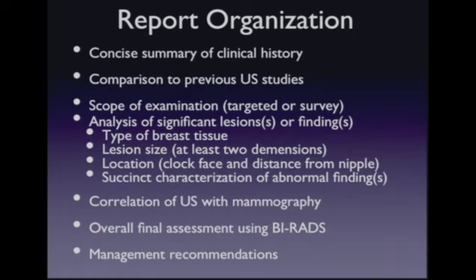And from that BI-RADS assessment, you want to give your management recommendations, and those flow based on the BI-RADS category. So if you have a BI-RADS 3 lesion, you will probably recommend a 6-month follow-up. If you have a BI-RADS 5 lesion or a BI-RADS 4 lesion, a biopsy is usually recommended.